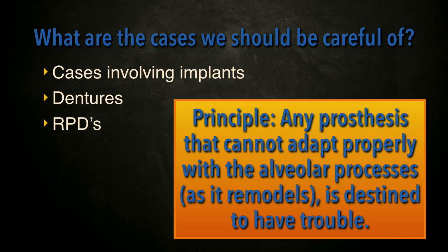The principle is any prosthesis that cannot adapt properly with the alveolar process as they remodel is destined to have trouble.